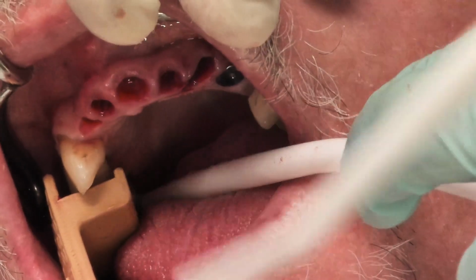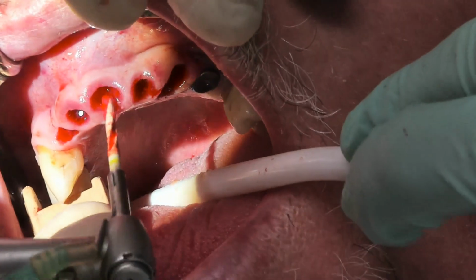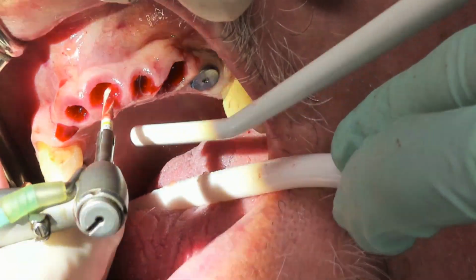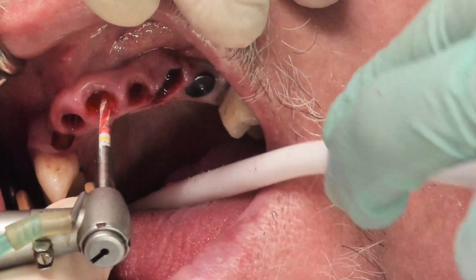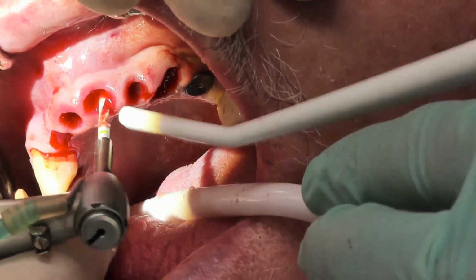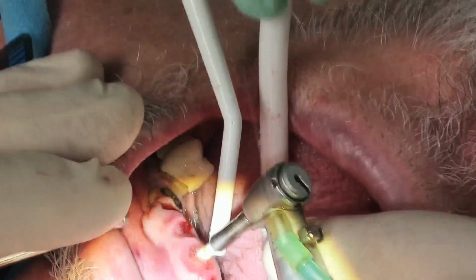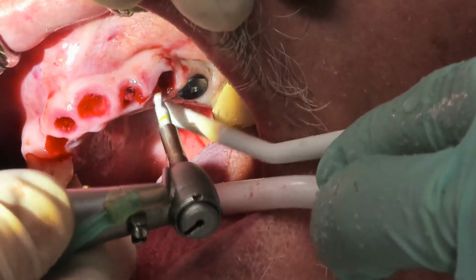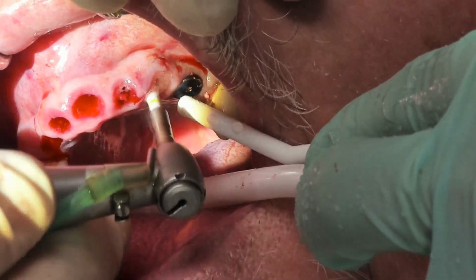What happened to the water, guys? Water's off? Or did I lose my thing? Yeah. A little bit. Okay. I don't have any water. This is at 1,350 RPMs. I like it a little more than 800. Okay. Water is off. Oh, yeah, I did that. Nicole, we could turn it down a little bit, too. Sorry. Perfect.